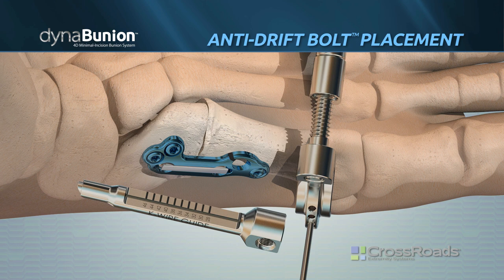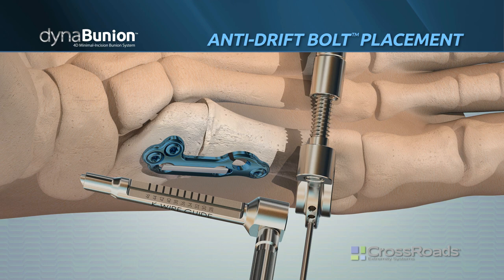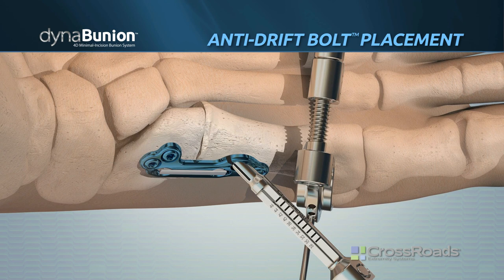Attach the universal handle to the anti-drift wire guide by threading the handle tip into the top of the guide. Dock the guide into the plate and ensure the laser mark line on both parts is aligned.